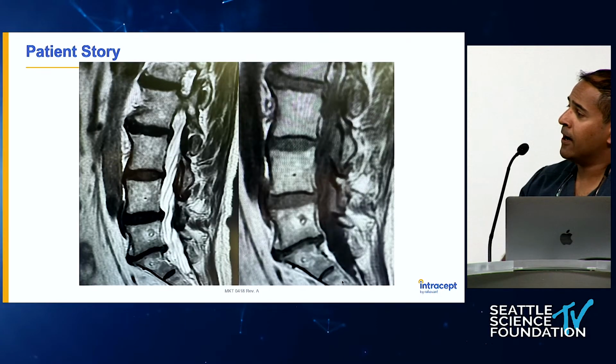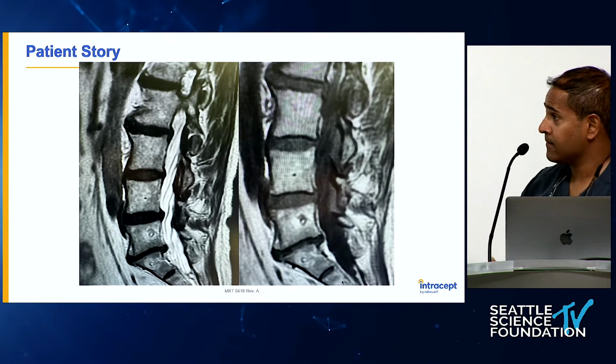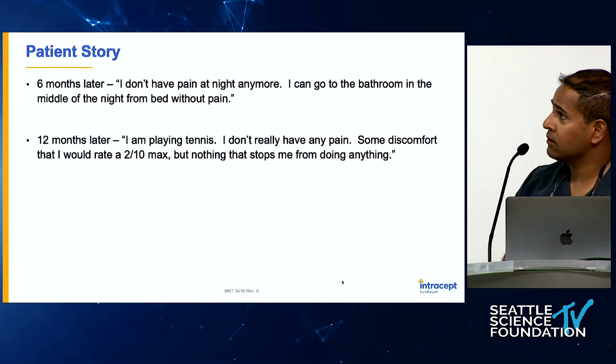I'm really reticent to criticize you, Ramana. No, you should. I am open to anything. A little bit too far forward on S1. Yeah, so I agree. So I was thinking, yeah, maybe it could come back and do it again. And I've done that. I did not do that with this patient.